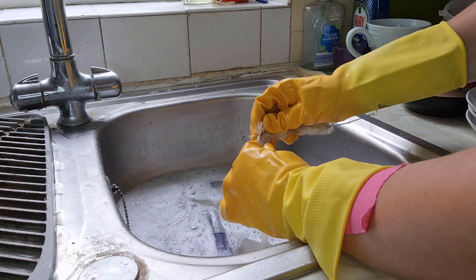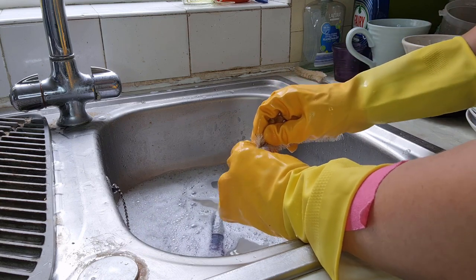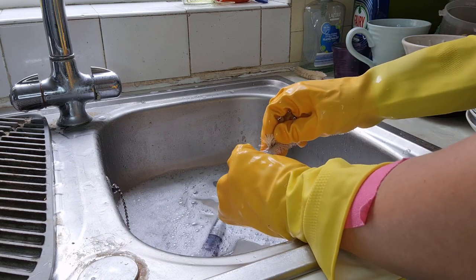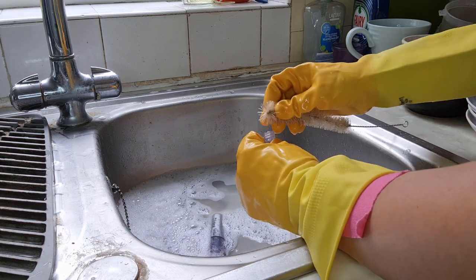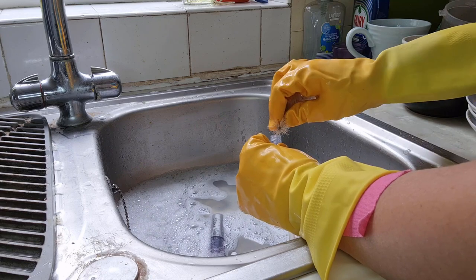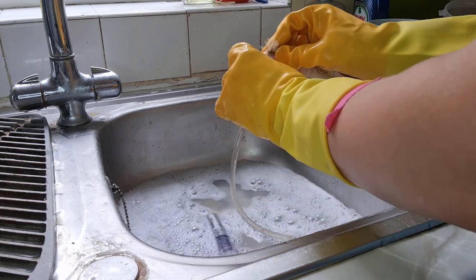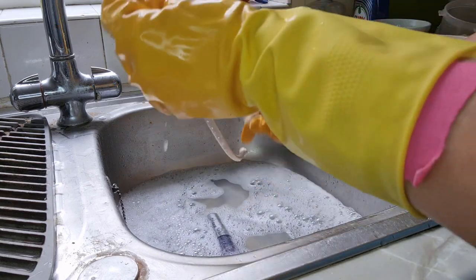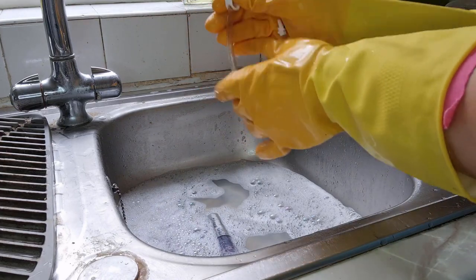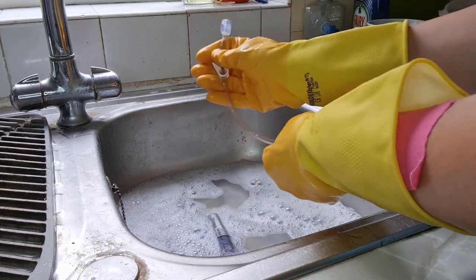And finally, tip number five for cleaning the feeding tube extensions, if you need to, is to put it in a sterilizer fluid. Here in the UK we have a cold sterilizer called Milton. It can be bought as a fluid or as a tablet that you dissolve in water. Some people whose children are very immunocompromised just let it soak in Milton afterwards.